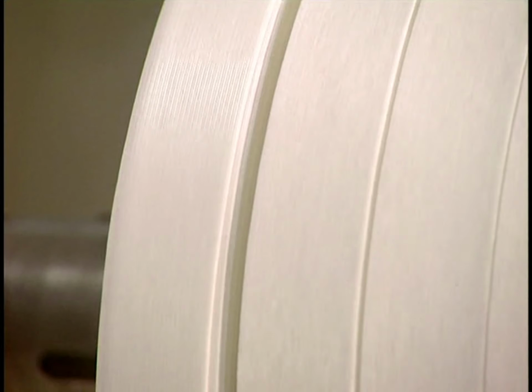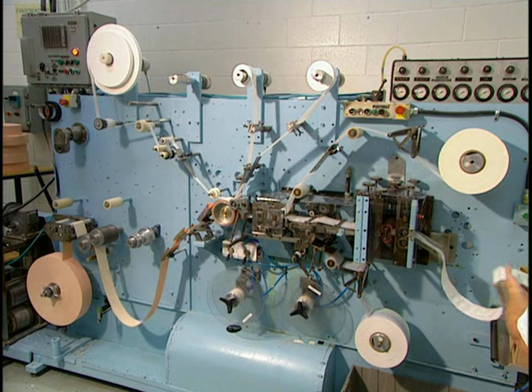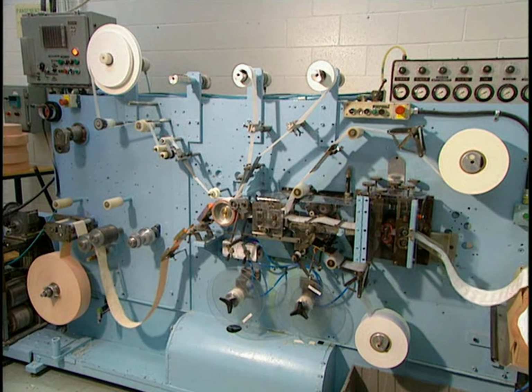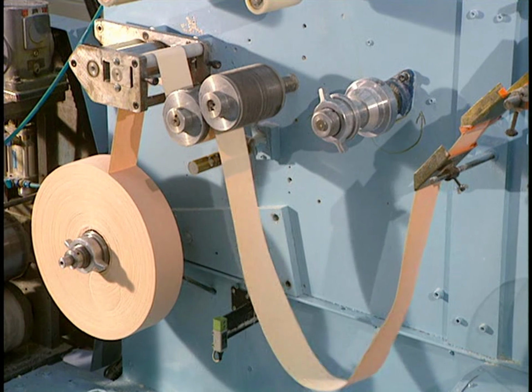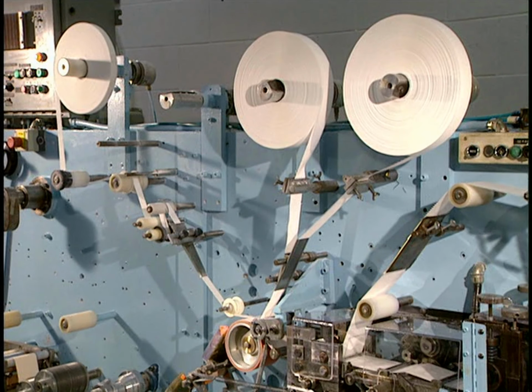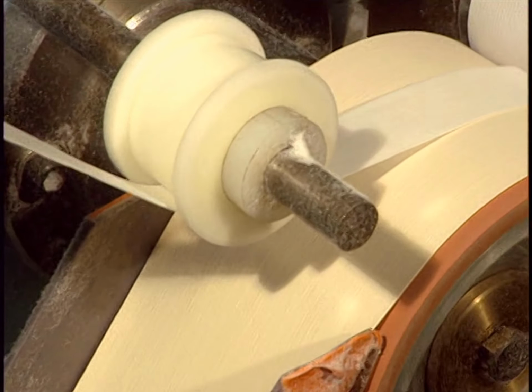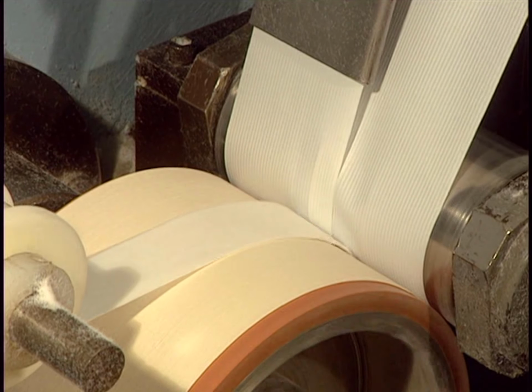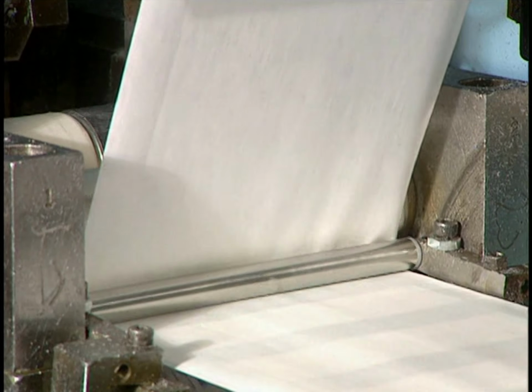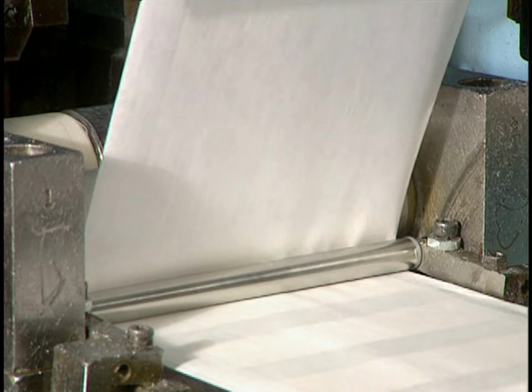The strips of cushion fabric are now ready to be applied to the bandages. This is the machine that fabricates the bandages. The roll of bandage components is unrolled. The machine assembles them, then cuts and individually wraps them. The bandages are wrapped one by one.